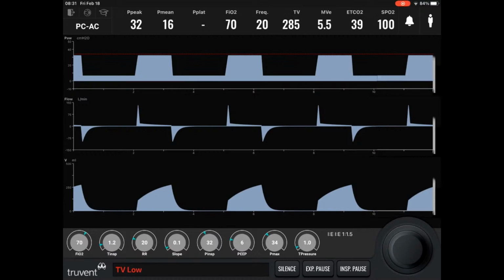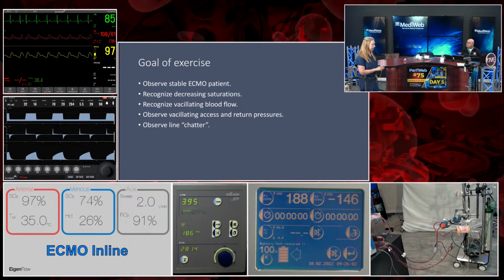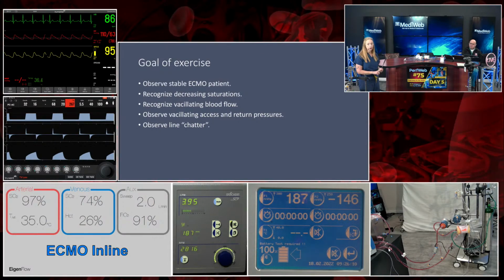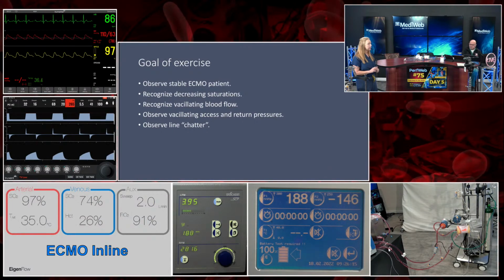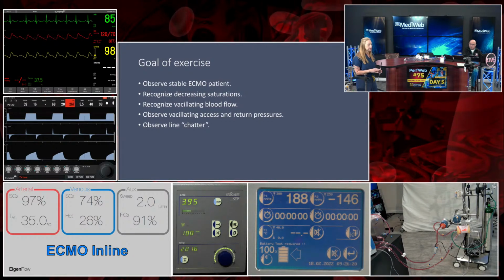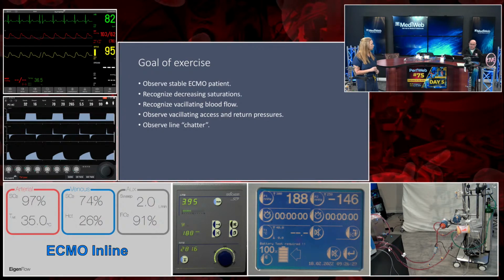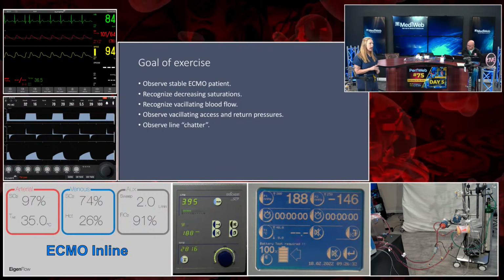There's no question. Okay, go back to Tammy and I. And if I may point out, in the meantime, while you've identified the problem but now you're waiting, someone's getting you albumin or whatever is occurring. One solution would be to decrease your flow slightly so that you are able to give a consistent flow, because a lower flow at a consistent delivery is better than intermittent flow. Absolutely. Another very good point. Turning your RPMs down would definitely help. No question about it.